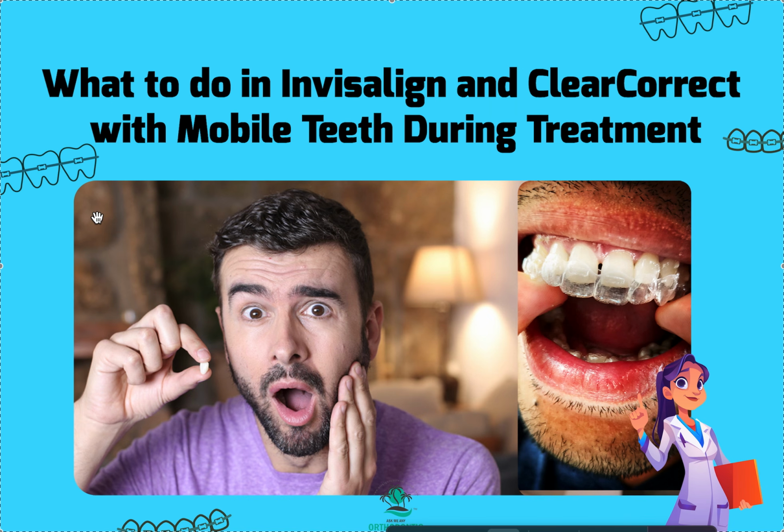Because usually the offenders are somewhere the front teeth, right, that are mobile. Did they move buccally during treatment? It'll say like 0.2B, as opposed to 0.2L lingual. I want them to either stay where they are, or I want them to move lingual if they are perio teeth. They are not allowed to move buccal.